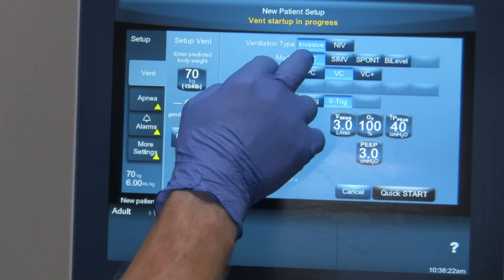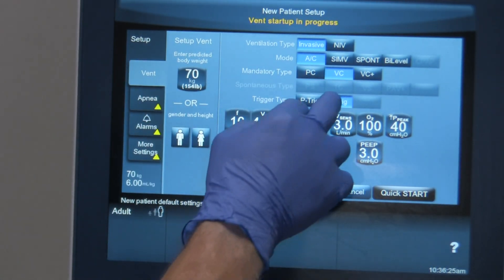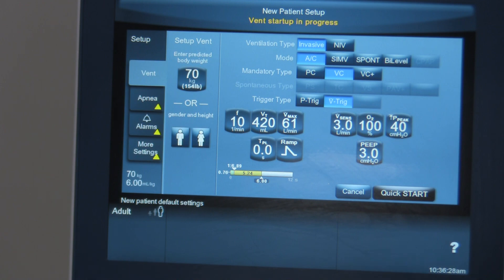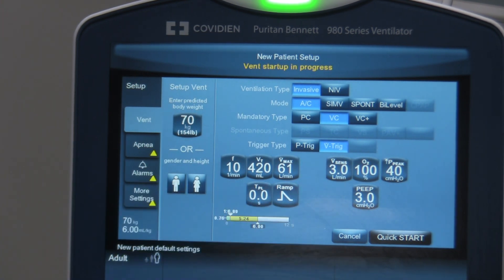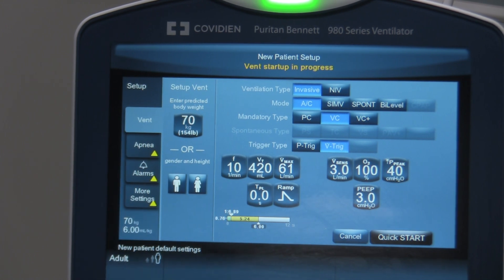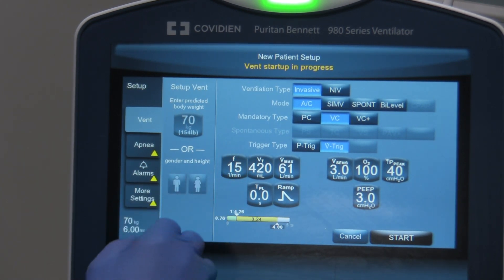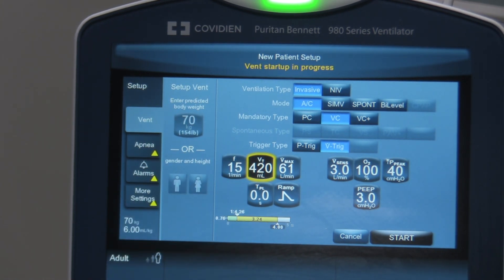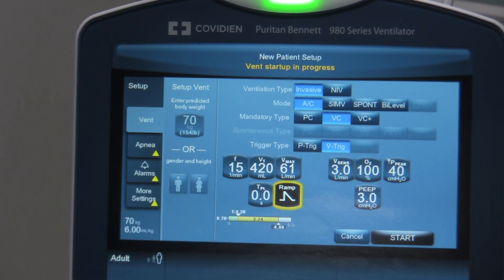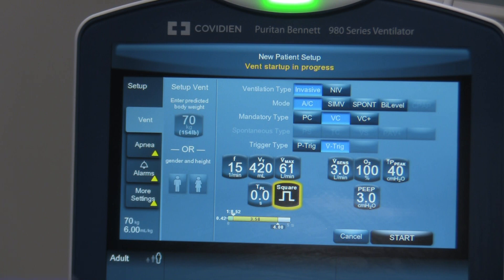We're choosing invasive ventilation — assist control mode, volume ventilation with a flow trigger. That's the default, so there isn't very much to change. Now we can set our values. Because this patient's normal, I'm going to start with a respiratory rate anywhere between 12 to 20 — I'm going to start at a rate of 15. They are 70 kilos, so 6 mils per kilo: 6 times 70 is 420 mils, which the ventilator has already programmed in. I'm going to change the waveform to rectangular, which will adjust my Ti, Te, and I:E ratio — so I've got it set to square.